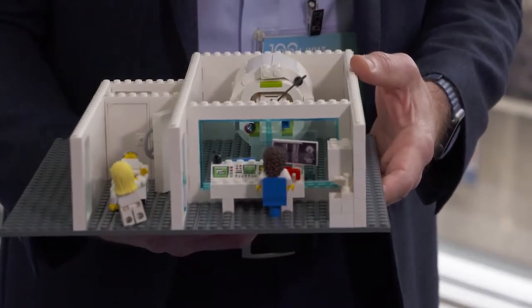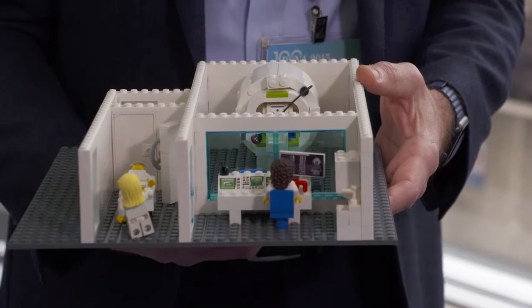We've got an interesting subject here to bring you. It's a Lego model of an MRI suite, and it's being demonstrated here at RSNA. Dr. Ranscher and Dr. Terrigan are going to tell us a little bit about why it was designed and what it's for.